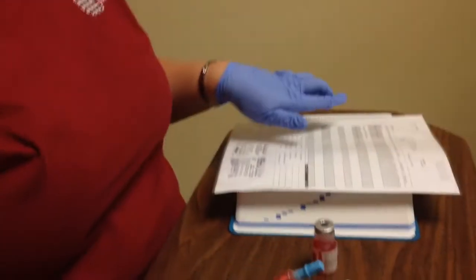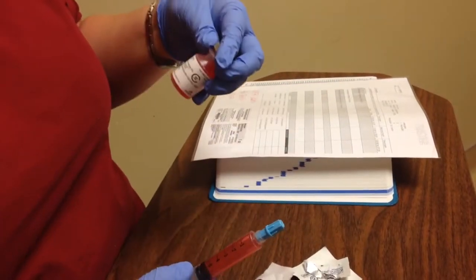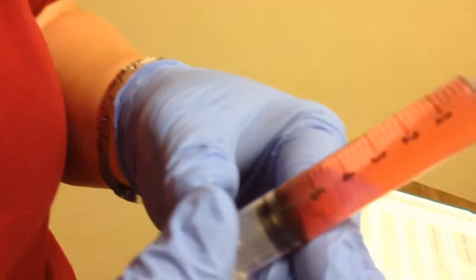I'm going to go ahead and do one more check on my medicine. I've got Demerol 50 milligrams. So I've made sure, Demerol 50 milligrams. Okay. I've diluted it in 5 milliliters of saline, so I have a total of 6 in here.